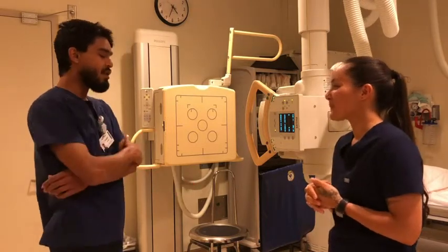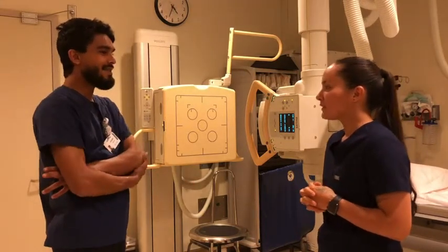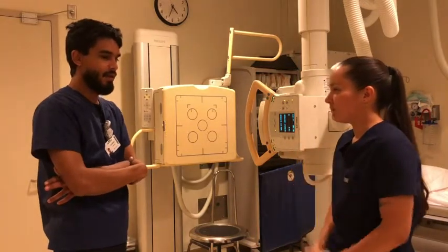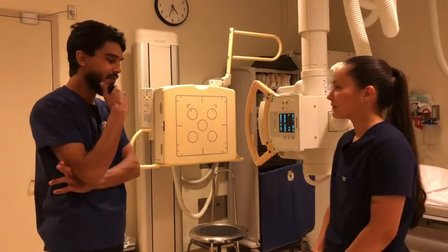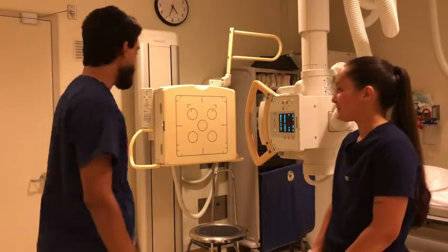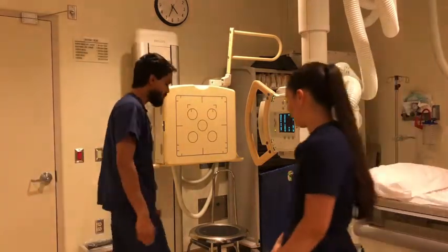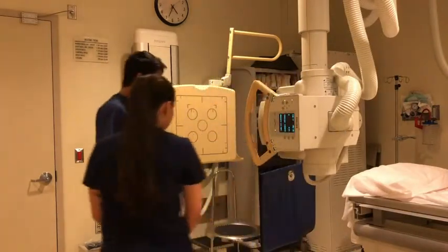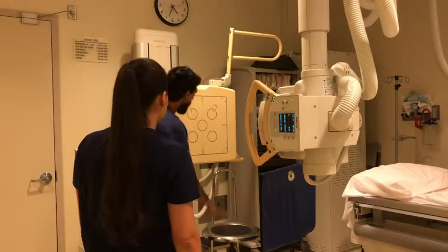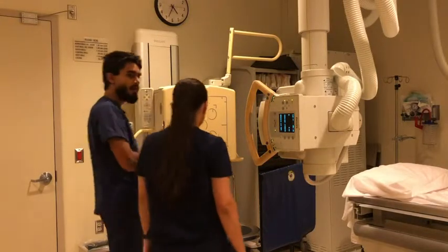So why are you getting these x-rays done? I've been having a stuffy nose and a lot of pressure for a week or so now. Okay, that seems like a good reason to get sinus x-rays. So let's go over to my x-ray machine. I'm going to have you start out by sitting on the stool and facing this wall Bucky.